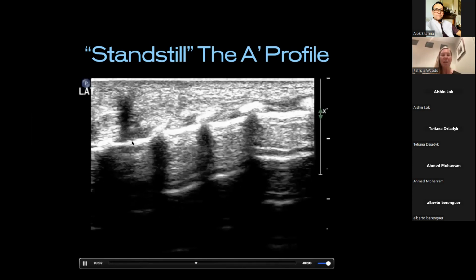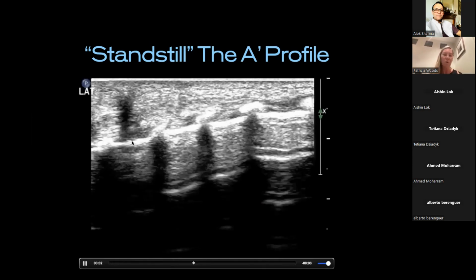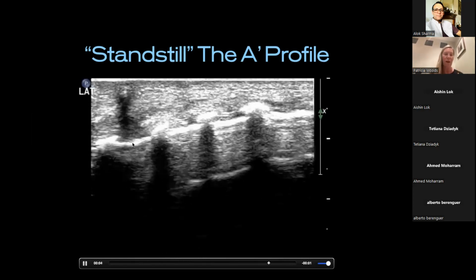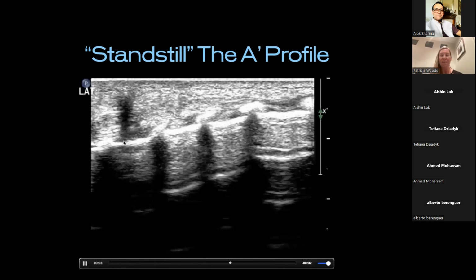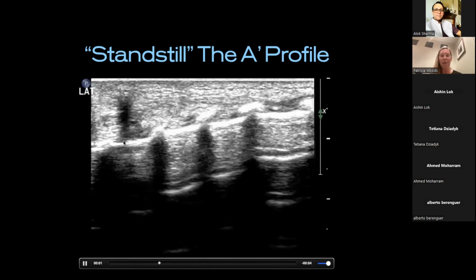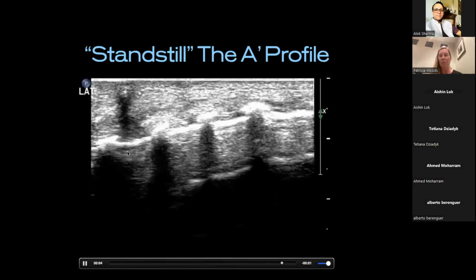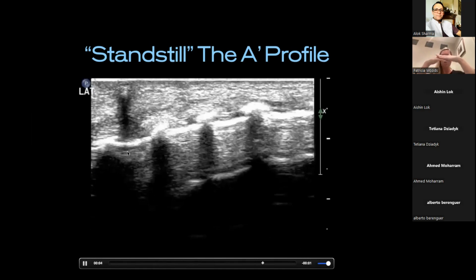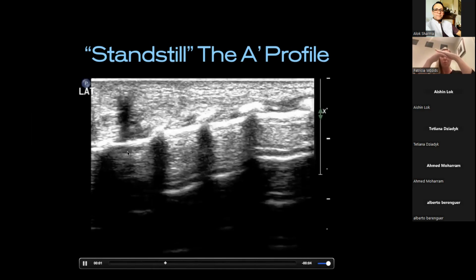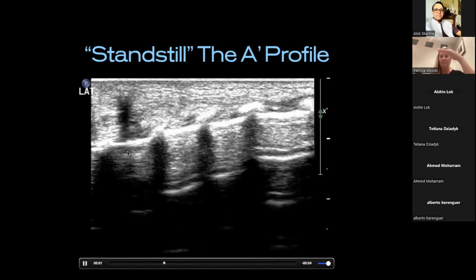This baby had pneumothoraces and actually had a catheter that was not functioning, probably blocked or kinked in some way, traversing the chest wall. And you're observing standstill. And I really want you to think why. You've got the chest wall there, the parietal pleura, but it's thin and defined, but there's no horizontal sliding at all. There's no movement at all. It's because you can't diagnose behind air.